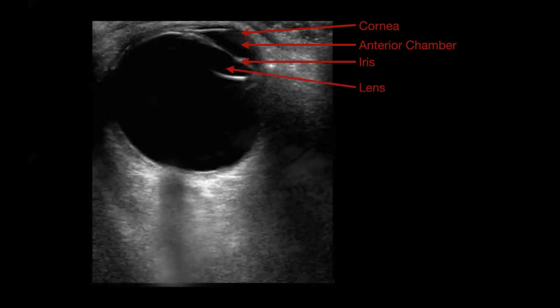If we turn that over to the ultrasound view, we can see these very same structures, maybe not in the same detail, but we certainly can see the cornea, right? That's that dome-like surface on the front part of the eye. And then deep to that, we have the anterior chamber, filled with fluid, the aqueous humor. So we're expecting a fluid-filled chamber. If you have a hyphema or something like that, you may have some echogenic material in there, but generally it should be black, or anechoic. And then you have the iris, right? That appears as a membrane between the anterior chamber and the lens of the eye. And then deep to that, we have the lens, which is also going to be typically anechoic unless you have a cataract.